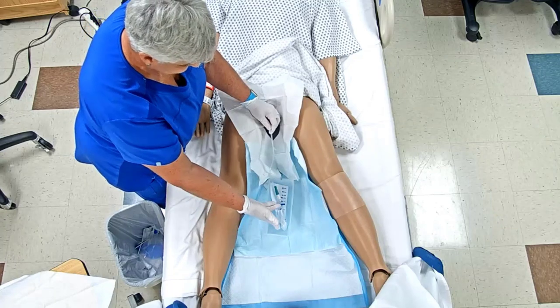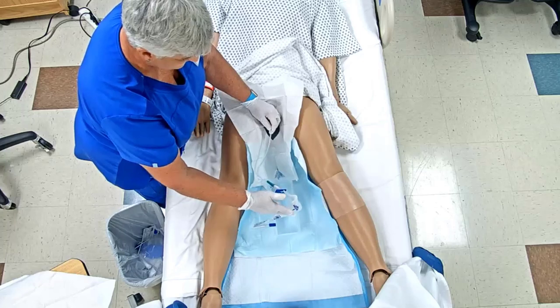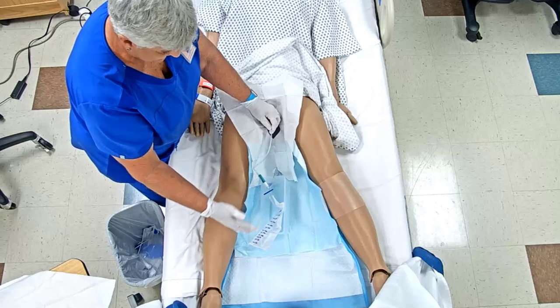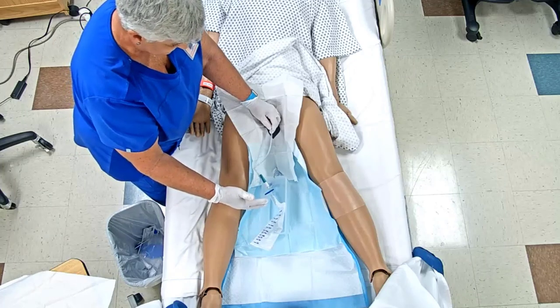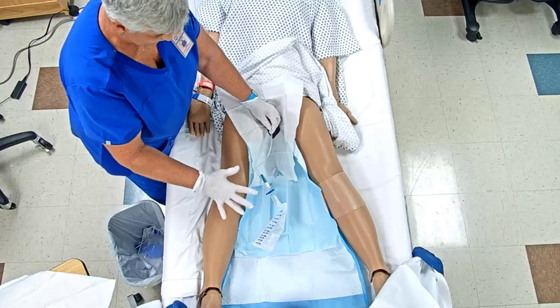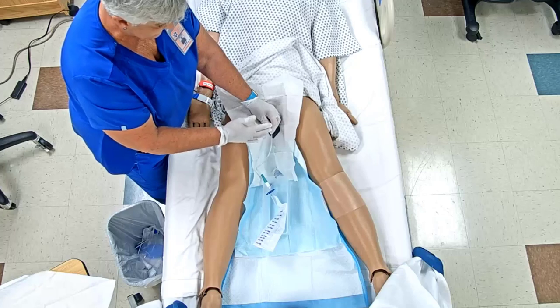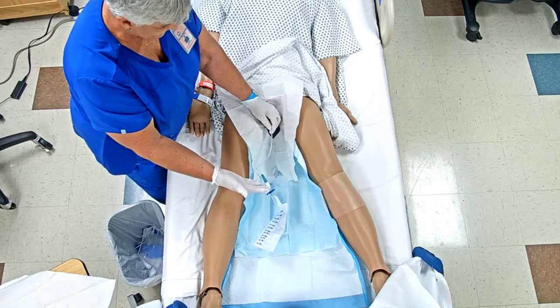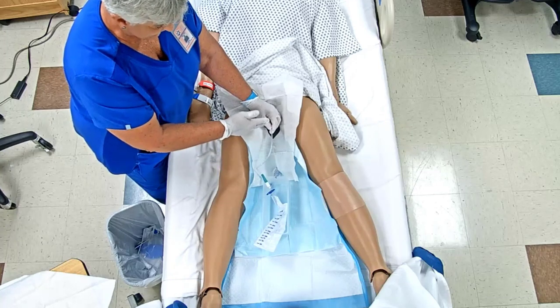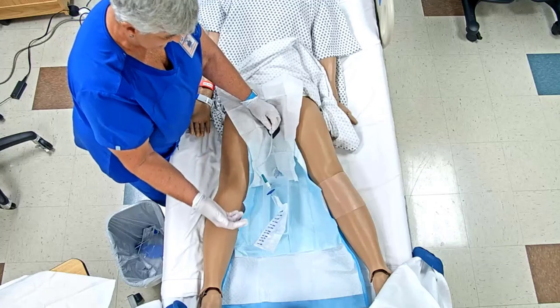And so I'm going to go ahead and let this fill up. Okay, so it's filling. May need to help it if I need to. Now the sterile part is over, okay, because what I needed to maintain sterile was the catheter. But this is not going to be in there. If for some reason it started to slide out, you've got to make sure you hold that in place. You cannot reinsert it once you start.